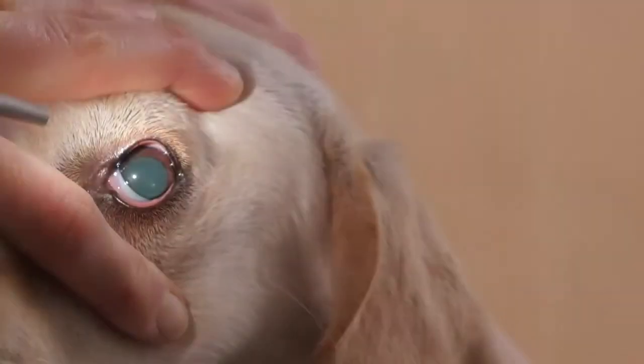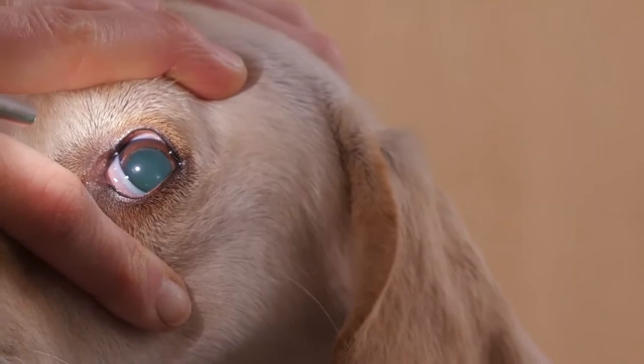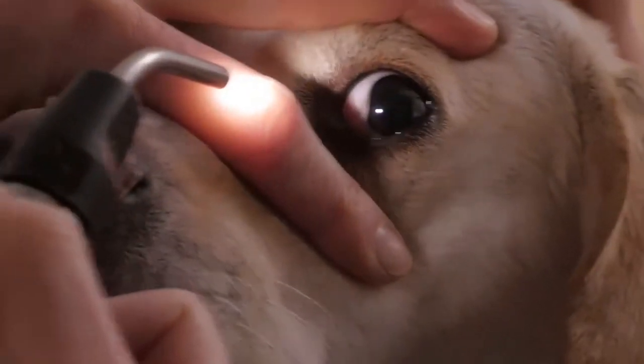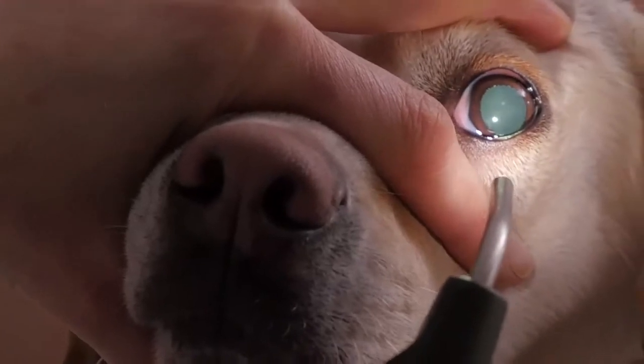Lens examination. The transilluminator is used to examine the lens for clarity, size, shape, and altered position. Retroillumination will aid the clinician in examining the lens and identifying lesions.